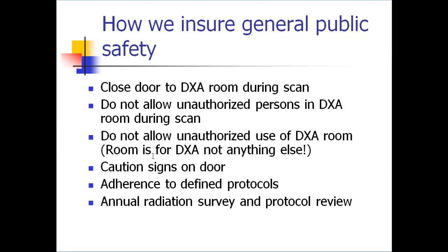We shouldn't have people in there changing, especially people who aren't trained around the DXA to begin with. It could accidentally be turned on, and then you'd be needlessly exposing someone to radiation, which does not follow the principle of ALARA. There are caution signs on the door to keep people from entering when a scan is occurring. Again, we adhere to the defined protocols, and there's an annual radiation survey and protocol review, which I'll go into next.